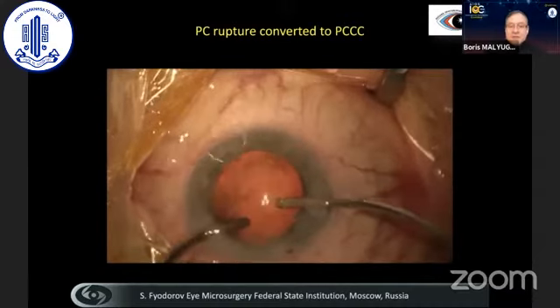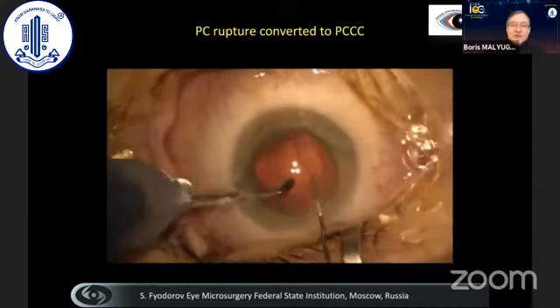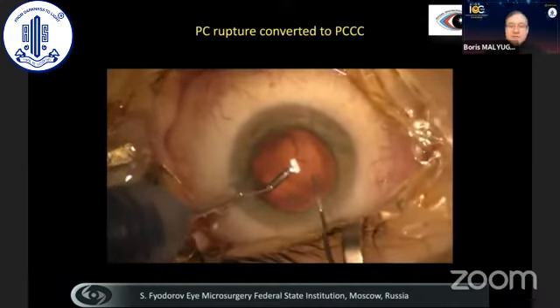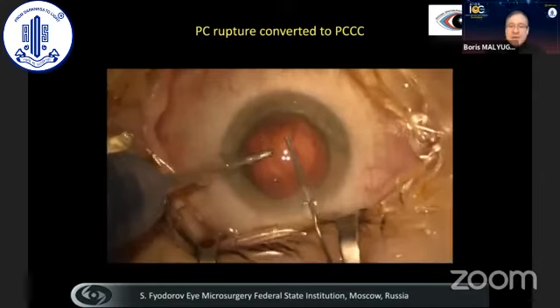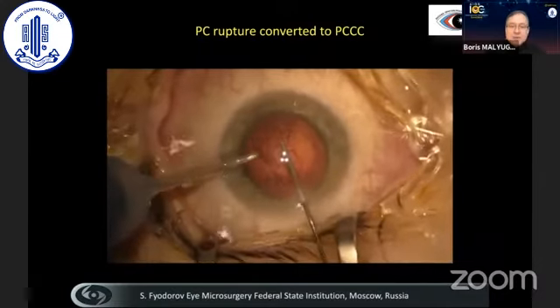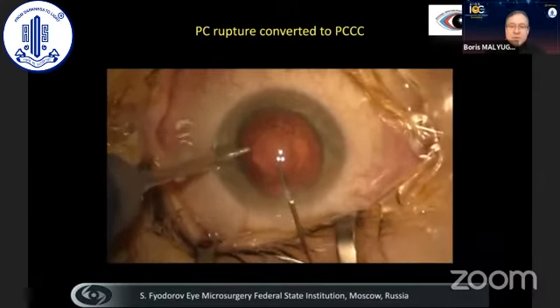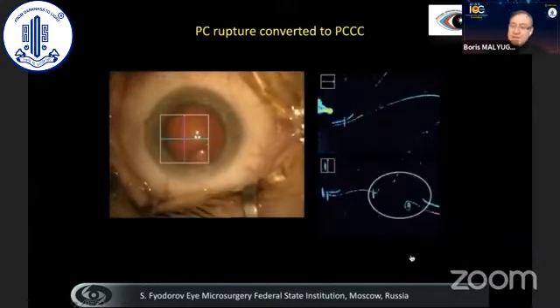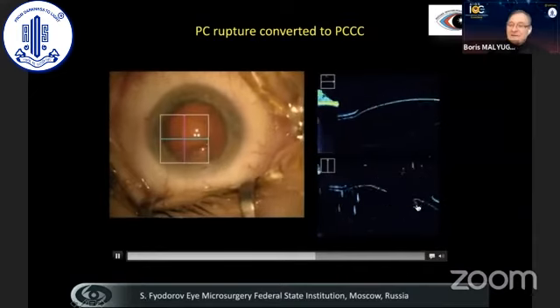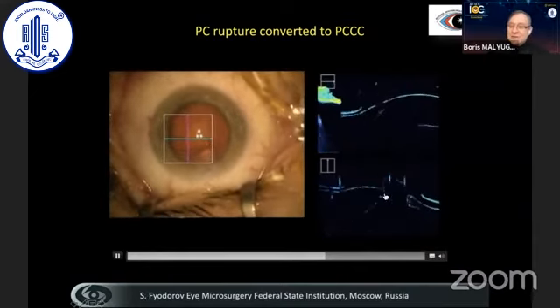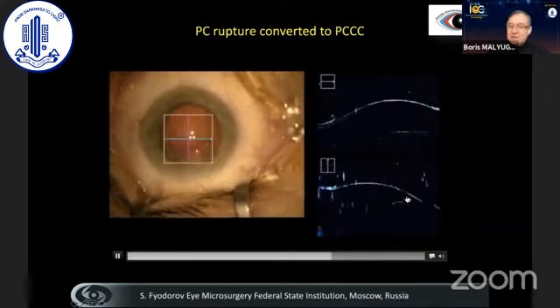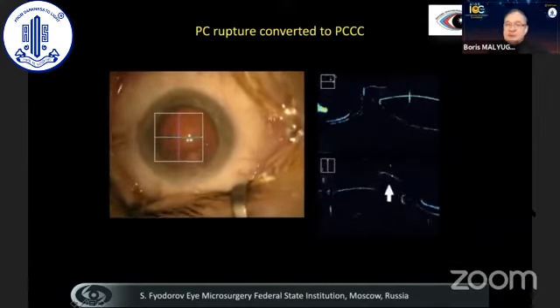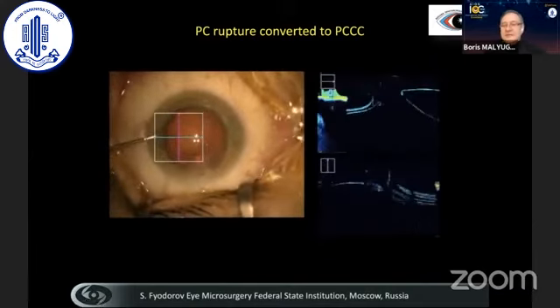Occasionally, depending on the instrumentation used, with a coaxial handpiece it is more frequent than with bimanual handpieces. We all know that at that particular moment we need to keep the anterior chamber filled. As already discussed, this is the rolled edge and this is the straight edge of the posterior capsule rupture — and you can see how the hyaloid is bulging forward through that capsule opening.